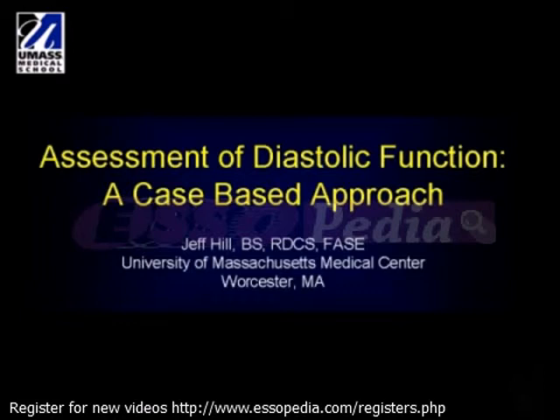I would also like to take the time to discuss in detail the validation studies for the Doppler tissue imaging and the estimation of filling pressures.